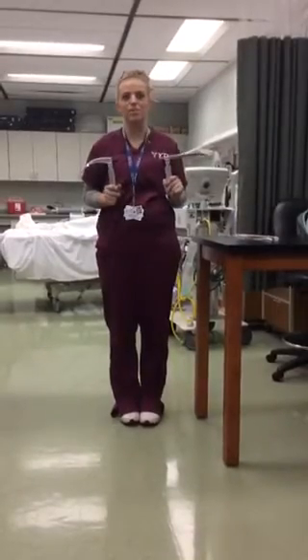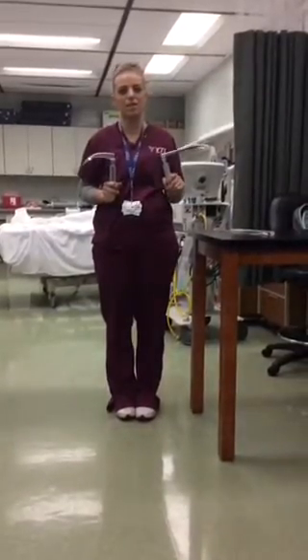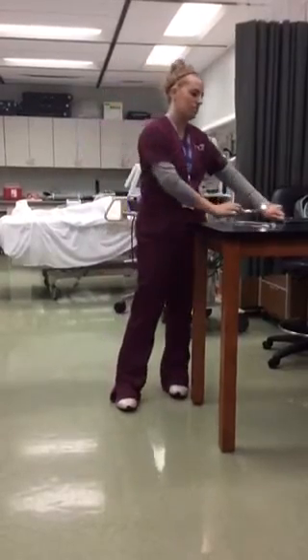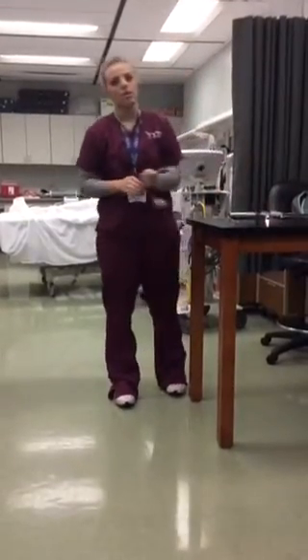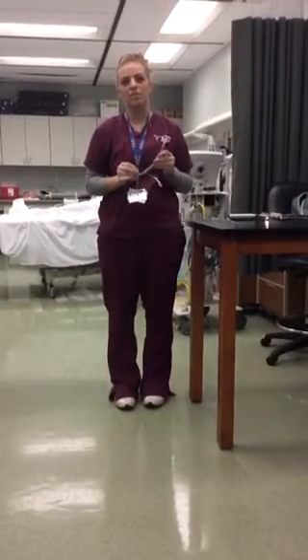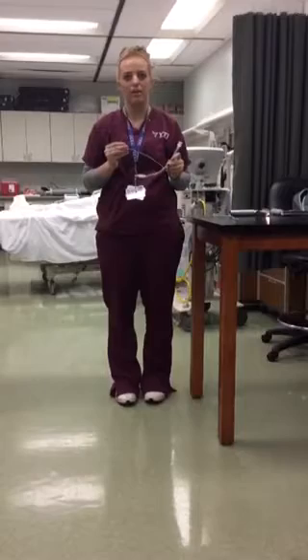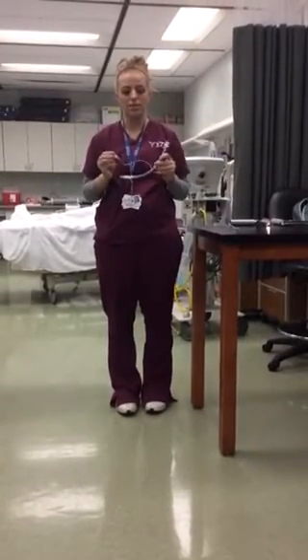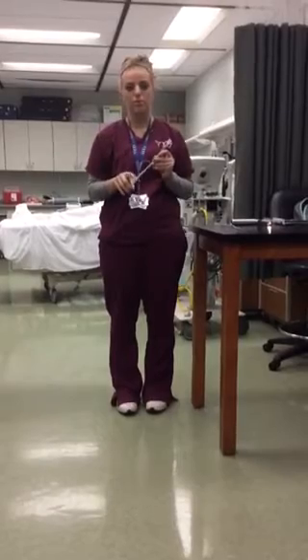We have two different types of a laryngoscope. First is a straight blade known as a Miller. Second is a curved blade known as a Macintosh. Next we have an ET tube known as an endotracheal tube, a small, usually plastic tube inserted into the trachea through the mouth to maintain an unobstructed passageway, especially to deliver oxygen to the lungs. This is the cuff, which inflates the balloon at the bottom of the ET tube or deflates the balloon.